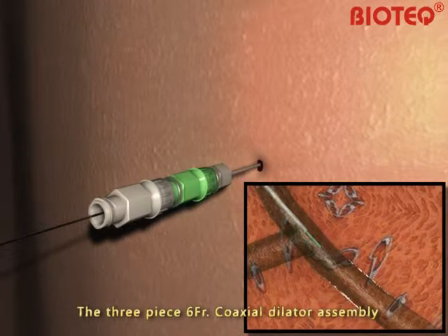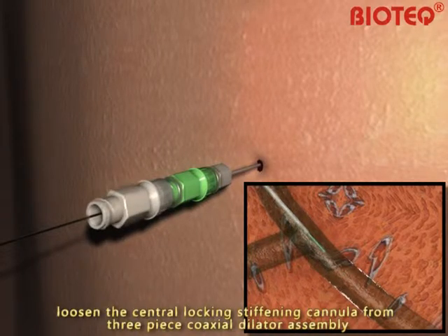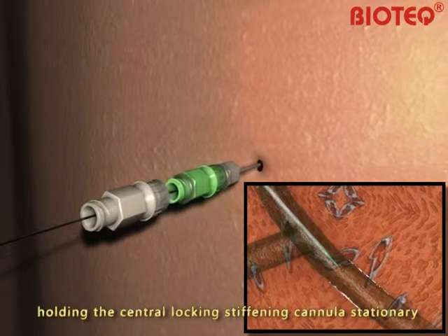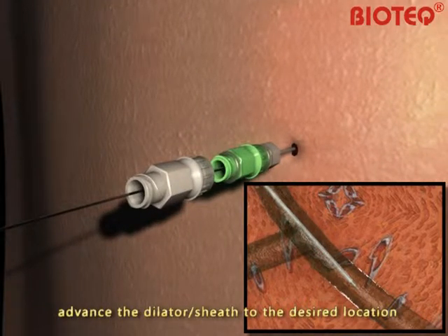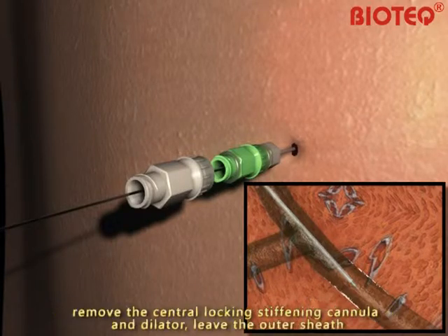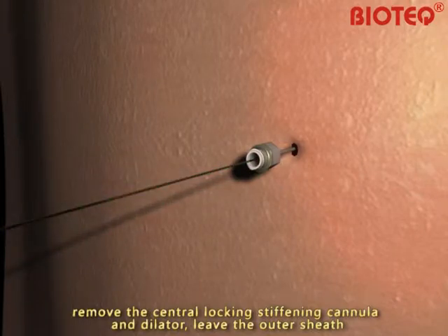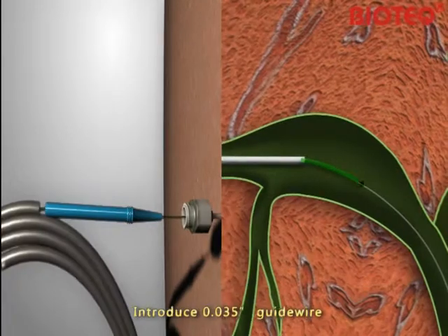The 3-piece, 6-French gauge coaxial dilator assembly is advanced over the 0.018-inch Nitinol guide wire into the bile ducts. Loosen the central locking stiffening cannula from the 3-piece coaxial dilator assembly. Holding the central locking stiffening cannula stationary, advance the dilator on sheath into the desired location. Remove the central locking stiffening cannula and dilator, leaving the outer sheath.